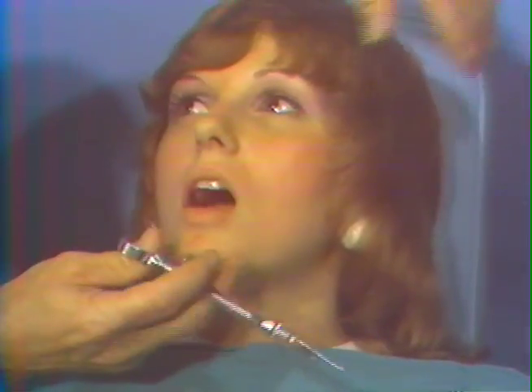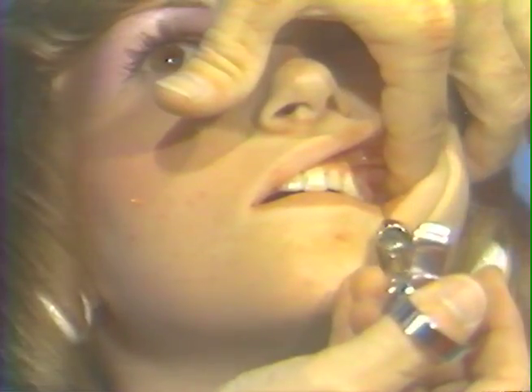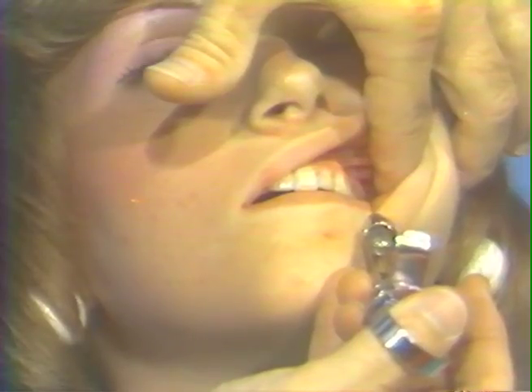I will now demonstrate conventional injection techniques for producing local analgesia of the maxilla. We will start by showing the upper left posterior superior alveolar nerve injection. Ready, turn just a little bit towards me, open a little bit wider. Let me pull your cheek, don't let me turn your head. And to this point right here, you can use the needle as part of the retracting mechanism of the lower lip. The needle is placed posterior to the zygomatic process of the maxilla. In this position here, as much in alignment with the teeth as possible. The posterior superior alveolar nerve injection.